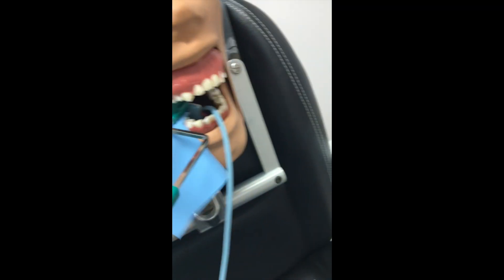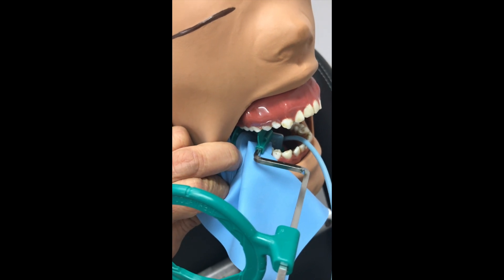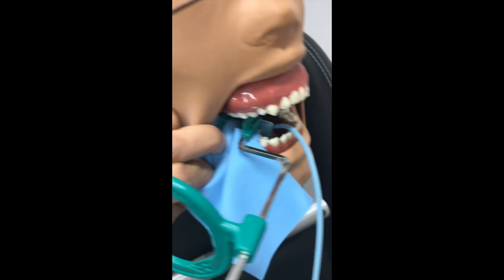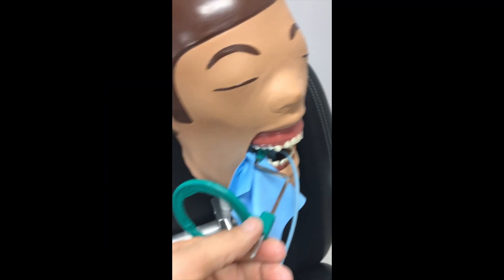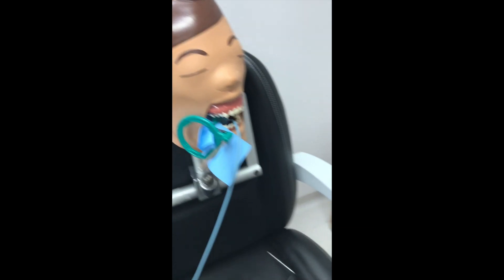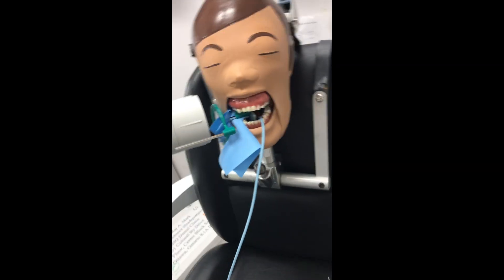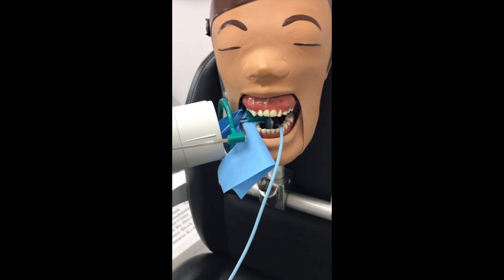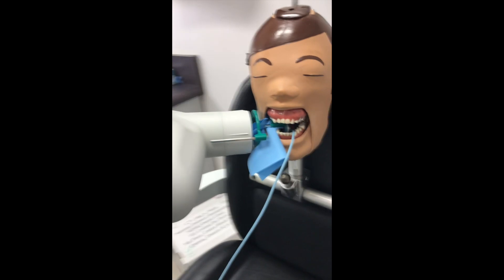We can see we've placed this in there, and the rubber dam clamp is right in the middle of the two slots. I'm going to get Dexter to bite down, and we slide that up with one hand. We've got that set up, we're taking our working length shot, and this is how we line the tube up straight — just like a regular paralleling device, pretty simple. Line it up like that, and that's how we get a straight-on shot.